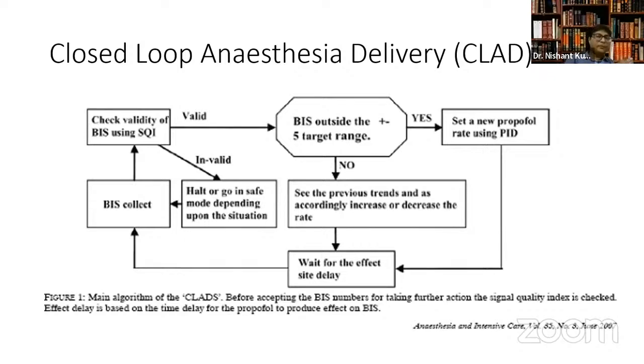Now, what they're coming up with is CLADS2. There, they're incorporating the TOF monitor also. The moment the TOF rises above a certain level, a bolus of neuromuscular blocker will go in. So it is sort of an automated anesthesia. All you have to do is set the values, sit back, relax, have a pop, coffee, WhatsApp, chat, and read the newspaper. But it is not so. We all know in anesthesia, this is what it seems to other people, but it is not so.